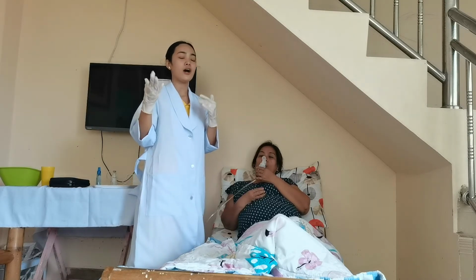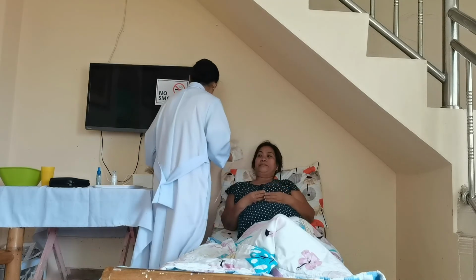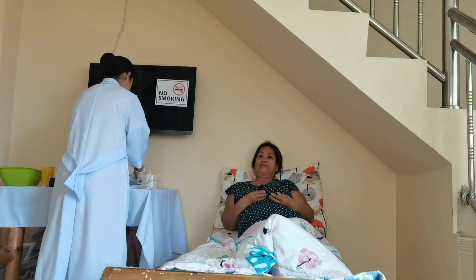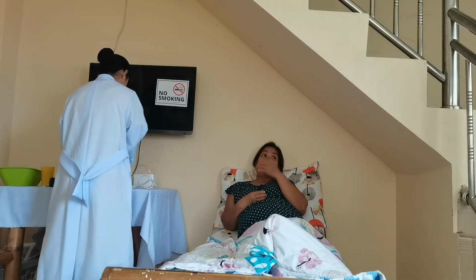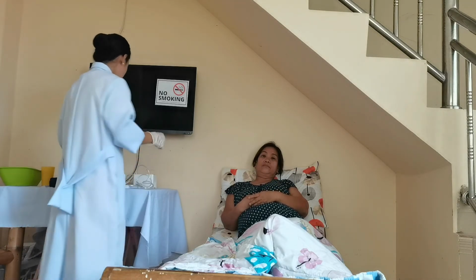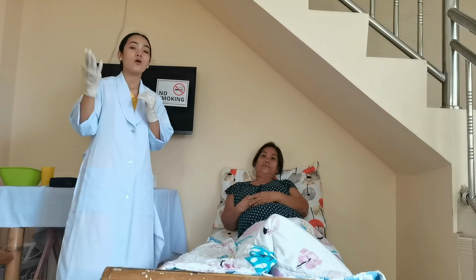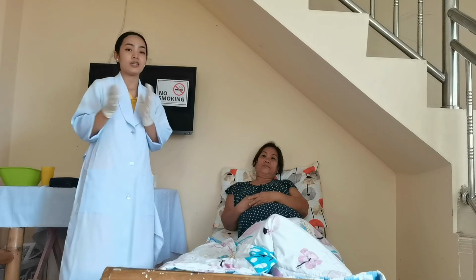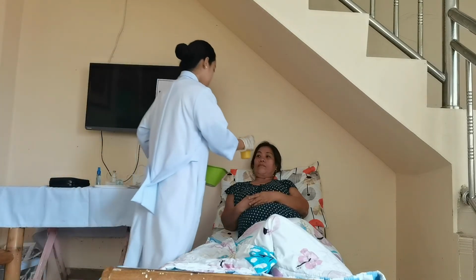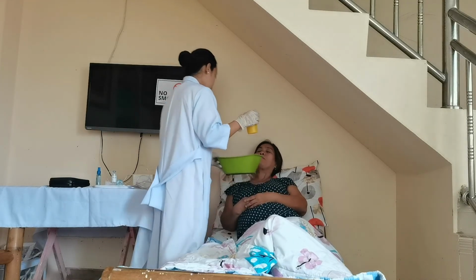So, assuming that we are done aerosolizing our medication, so okay na po. So once we are done aerosolizing our medication, we will have our patient gargle and wash using tap water after medication administration. So ma'am, mumug lang po tayo. Alright po.